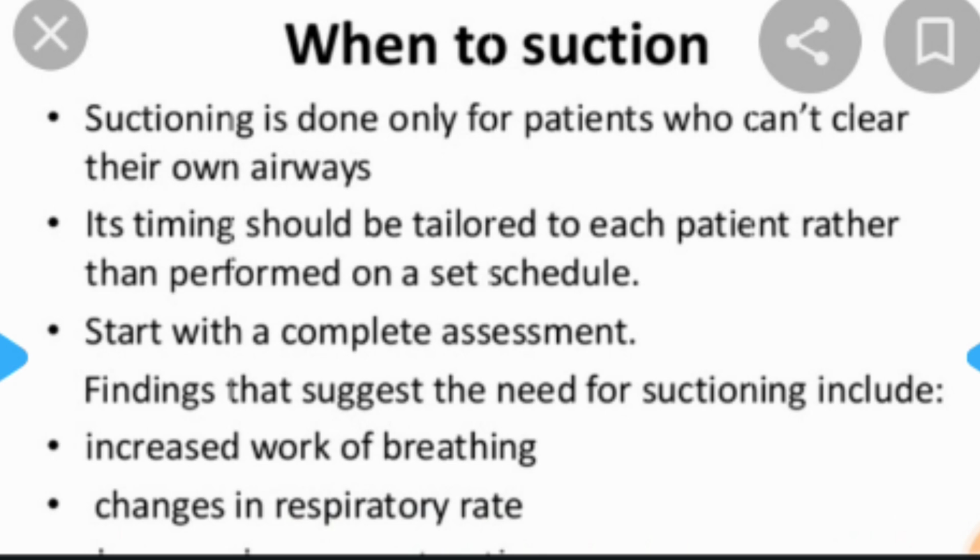Start with a complete assessment. We have to do the complete assessment for the patient. Then only we can know whether the patient needs suction or not. Findings that suggest the need for suctioning include increased work of breathing, that means the patient is having tachypnea, so we have to do the suction, then only we can decrease the breathing rate of the patient.